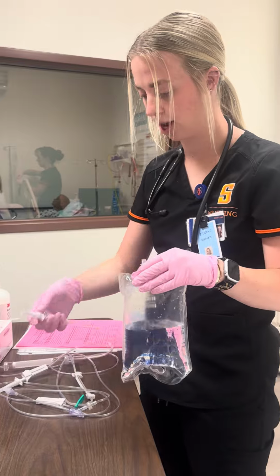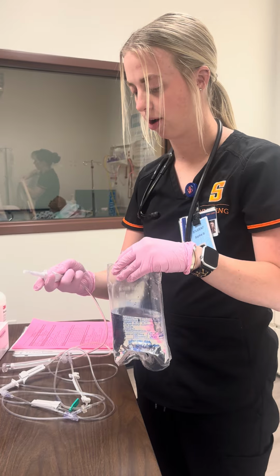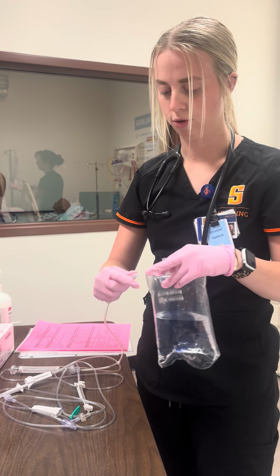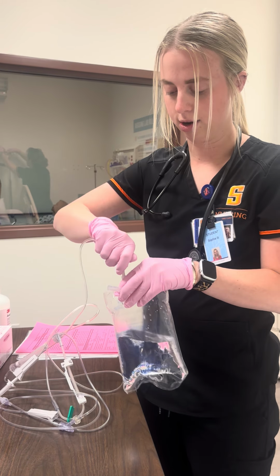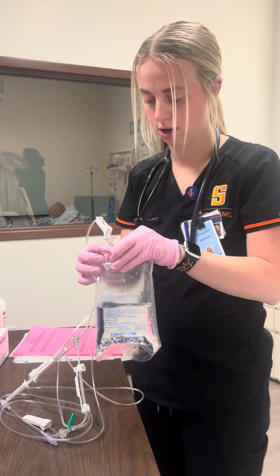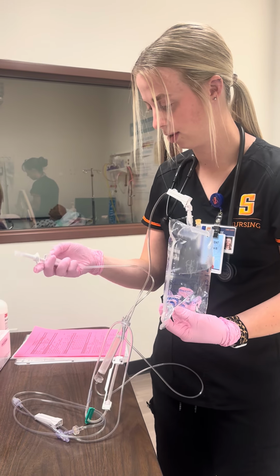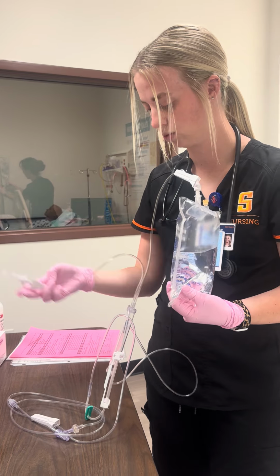We aren't going to do that. I'm going to clamp off this where I'm plugging it in, remove my cap, and spike. For sake of everything, we're going to clamp this one off as well.